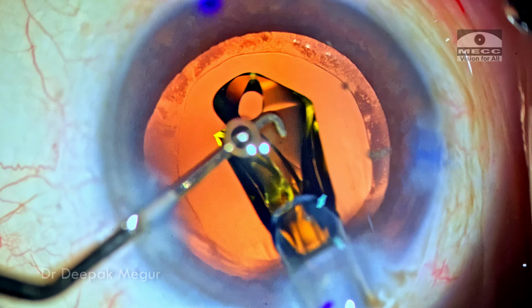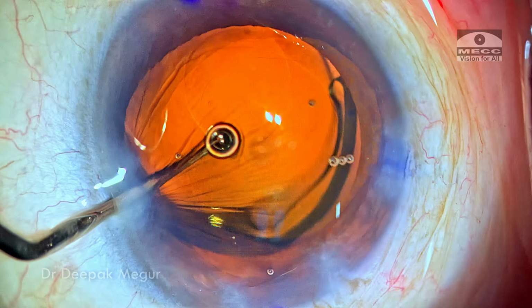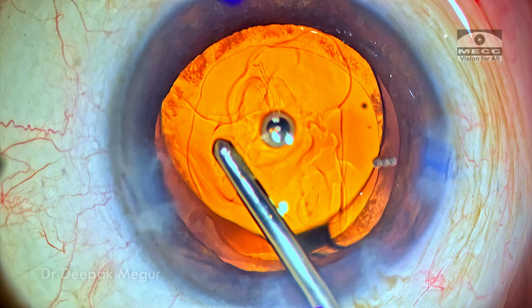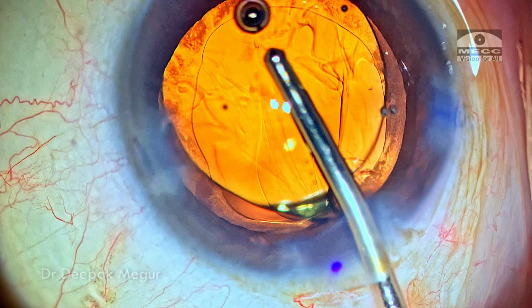Time to implant the lens, and the lens is being placed into the bag. The lens implantation is nice and easy. Time to remove the OVD. As the irrigation cannula is being introduced, again I remind myself that it's time to reduce the bottle height. Having a mechanized stand does help to vary your bottle height.